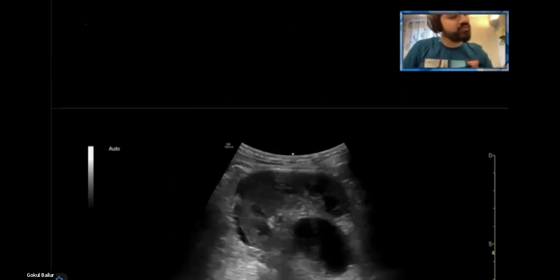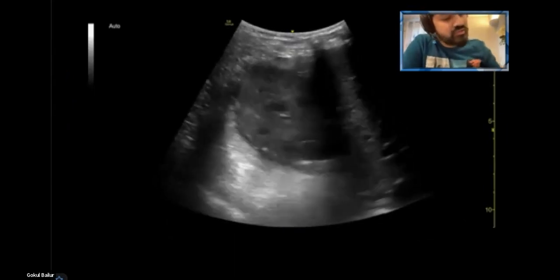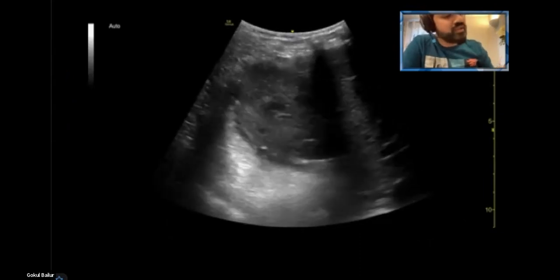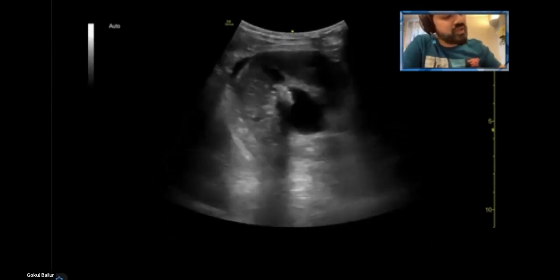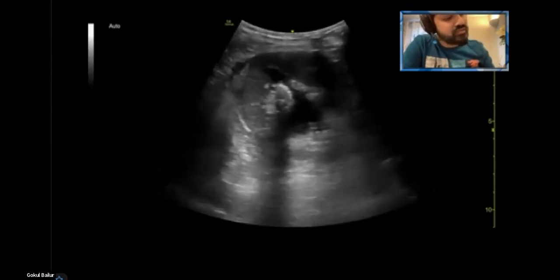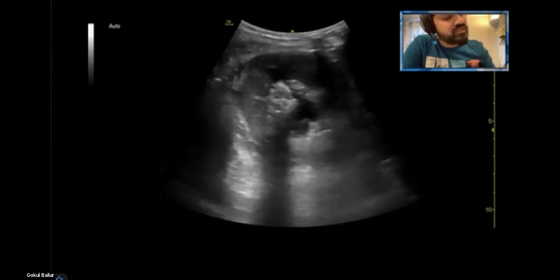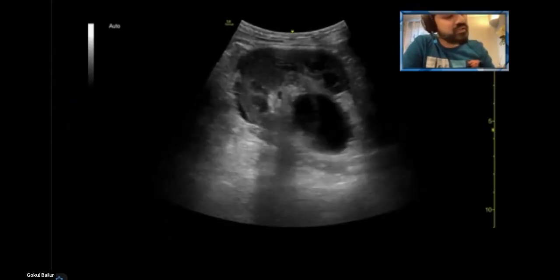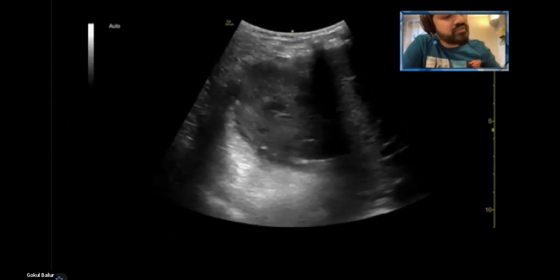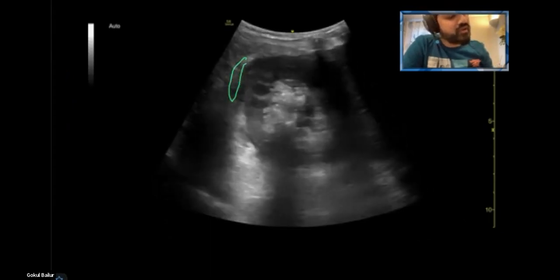And going ahead and looking at the short axis of the kidney. Again, I'm just fanning through. It's a 2D image, but you want to see the whole kidney. So I'm fanning through to the upper pole here, and you can actually see the hydronephrosis, the dilated pelvis, dilated calyces, large echogenic material in the middle with shadowing that might suggest a stone, and a bit of free fluid that I can see just there around the kidney.